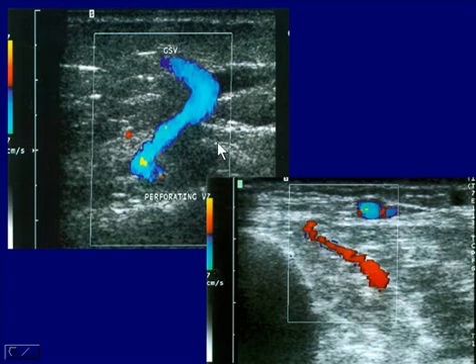Here we have a good color image of a perforating vein. We don't really see the great saphenous too well because we're sort of off plane, but we can see the pathway of this perforating vein, and it's color coded in blue, so we know flow is going away from us, as compared to this vessel, which is color coded in red, and it's coming up. The flow is coming up towards this great saphenous sitting up here. So this is retrograde flow, and this is an incompetent perforator.